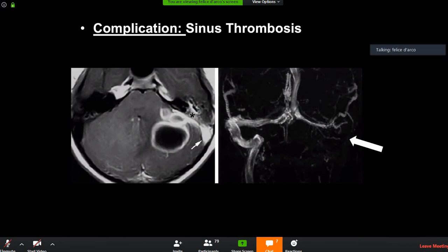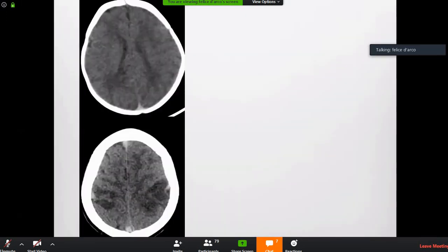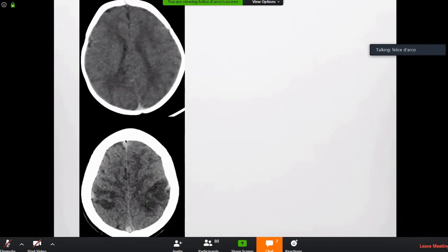If you do a 3D T1 pre- and post-contrast, combined with an MRV, you will have all the information to diagnose a thrombus. Remember: if you have an MR, do a 3D T1 post-contrast gradient sequence. Now look at these two scans — there is an obvious difference in hypodensity. A fellow called me asking whether this was venous sinus thrombosis because the sinus appeared hyperdense.